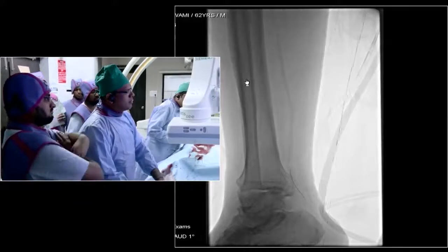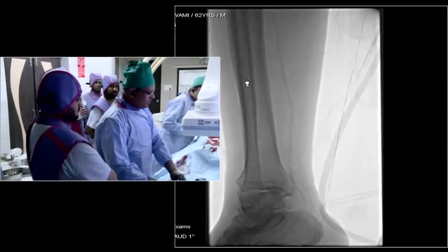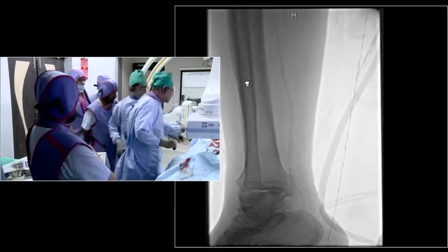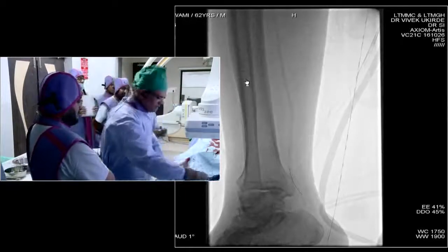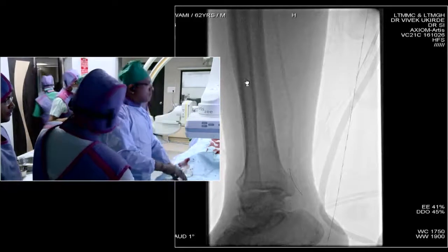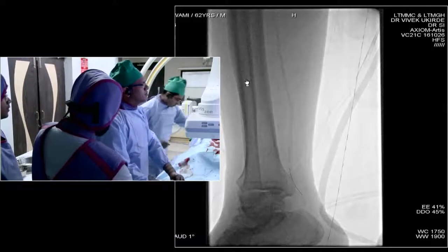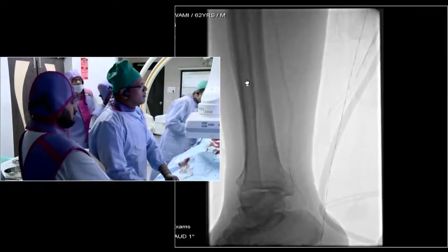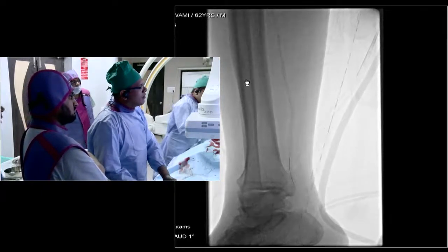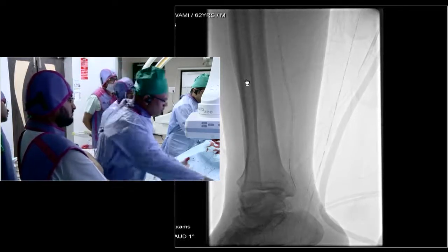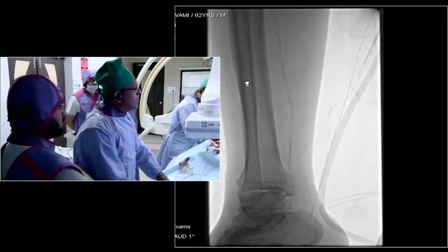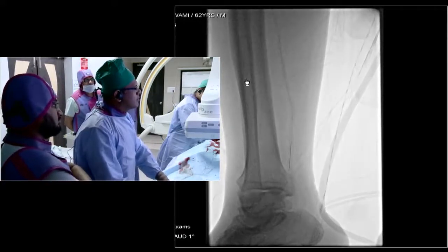The wire is coming back. You can cut the balloon on the wire if you are losing it. This is another problem with over-the-wire balloons — it becomes difficult to remove the whole balloon while keeping the wire in. Two things I do: flush the balloon catheter wire lumen very nicely, and always have good saline to wipe the wire during any exchange. That helps take the catheter out very easily; the hydrophilic coating inside becomes sticky and can pull out the wire.